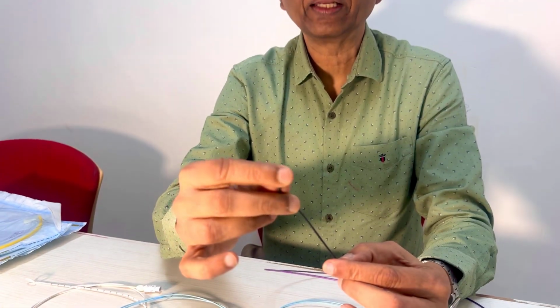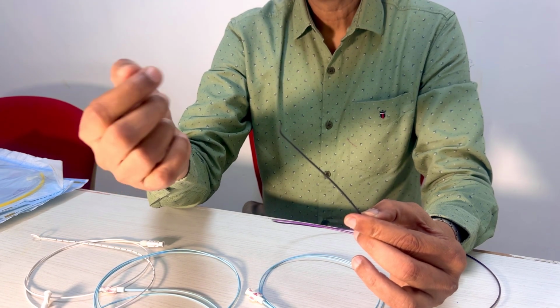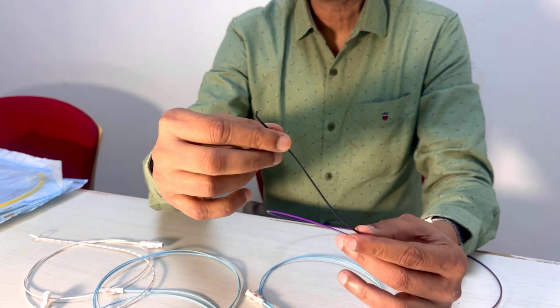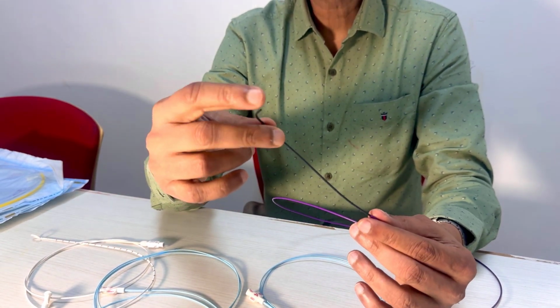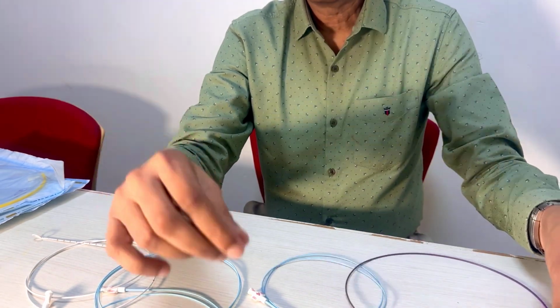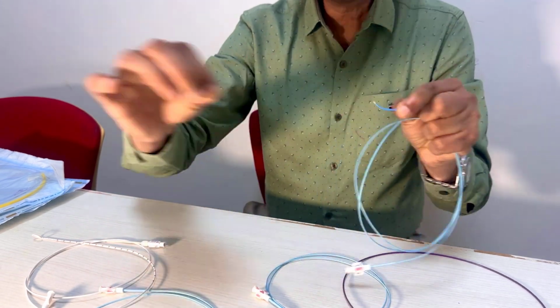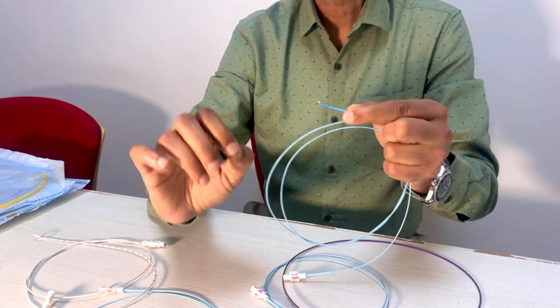For example, this catheter, can you look at this black component of this catheter? This doesn't have braiding. So what will happen? I can easily break it apart. And I'll break it apart towards the end of the class after I talk about the shape, just to make you understand that these catheters can be easily broken. Whereas if you look at any of these catheters, however hard you pull it, whatever you do, they don't break.